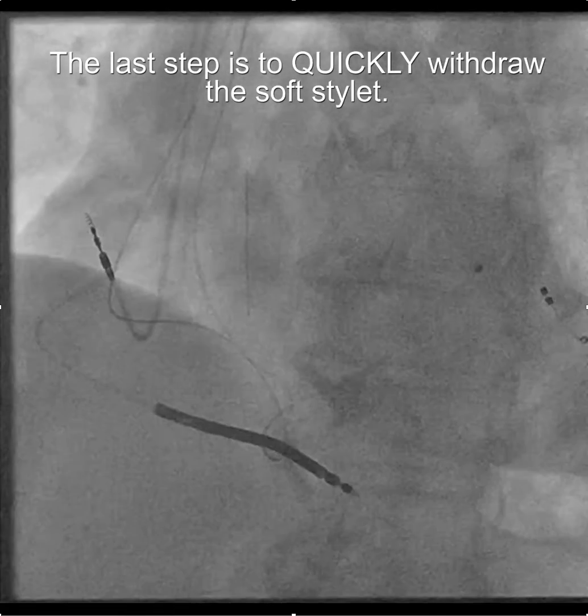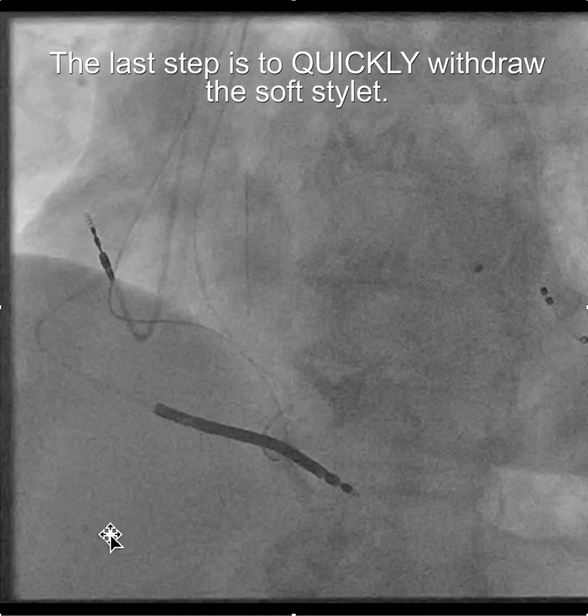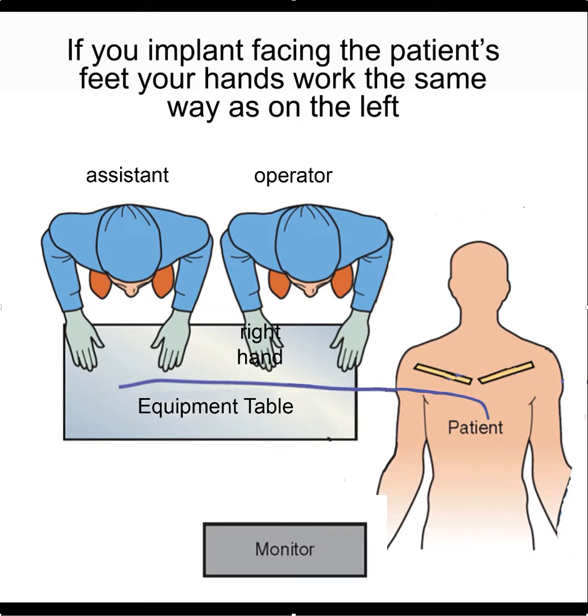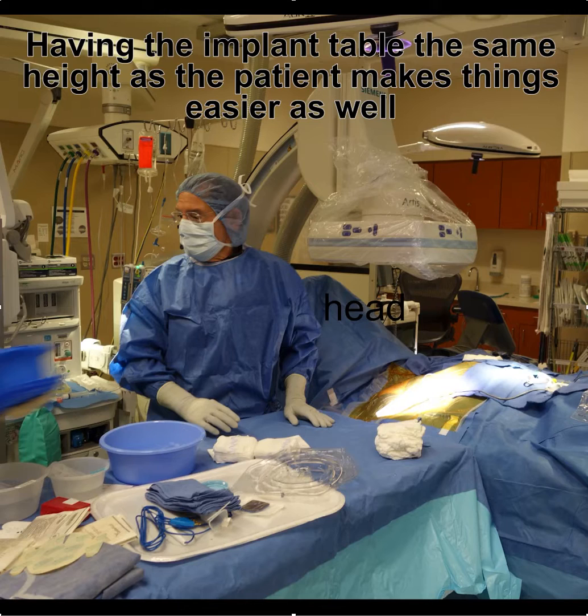It's a little worrisome when you're doing this because you're concerned that the tip of the amplatz wire will grab the lead, but that usually doesn't happen. The final step is to remove the stylet. I hope you find this helpful.